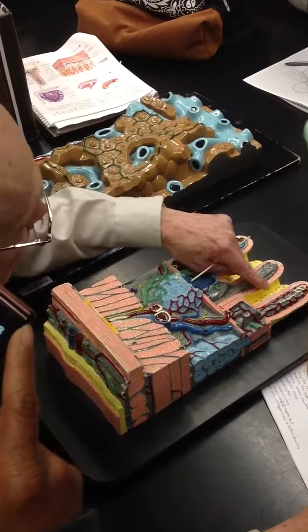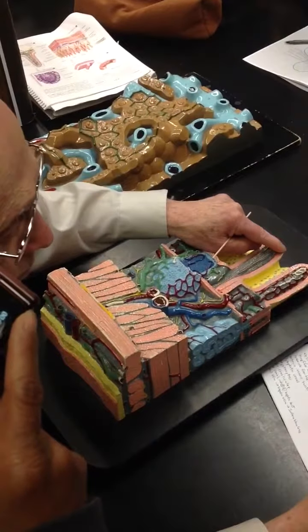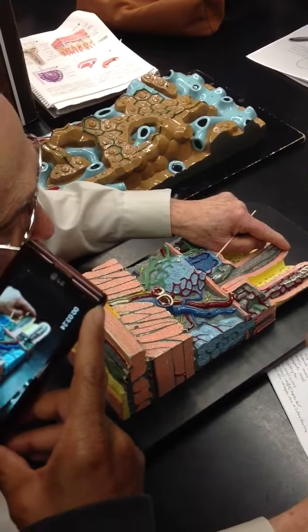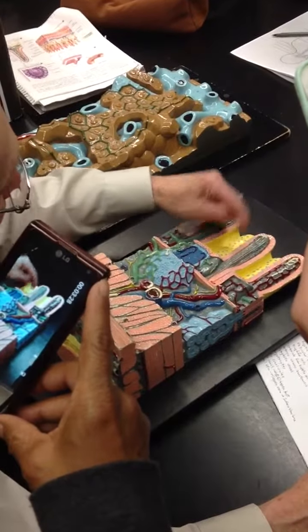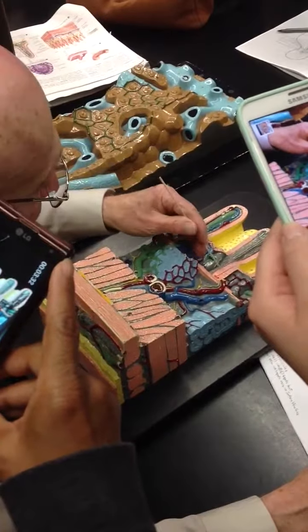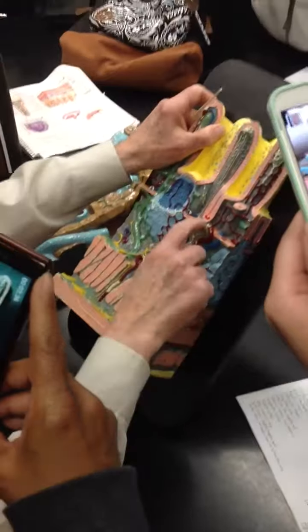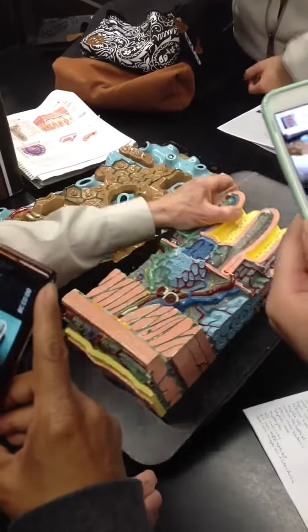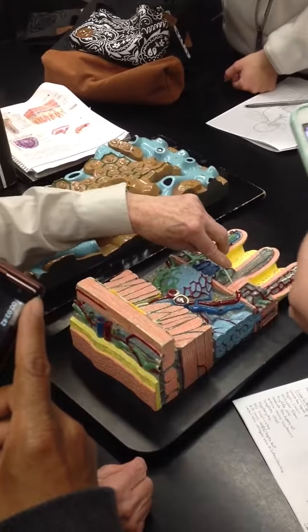The columnar epithelial cells are all along here. The little blue dots are goblet cells that secrete mucus. Goblet cells that secrete mucus. Okay. Paneth cells are these red things down here. See them? These red things down here.